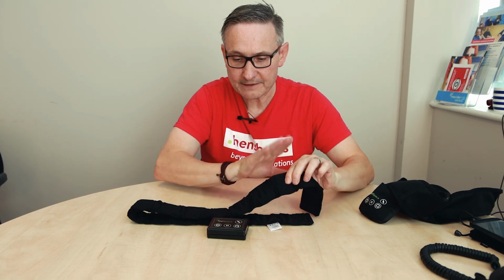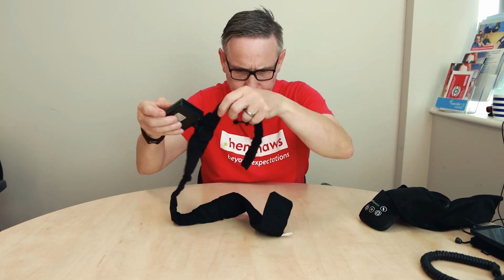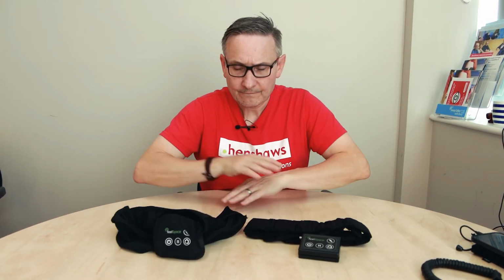1, 2, 3, like I said, 16. And that's the brain of it all, and the battery. And it weighs nothing. In fact, the sensors probably weigh a little bit more than that. But all in all, it's quite lightweight and you don't really feel it when it's on. So there you go.